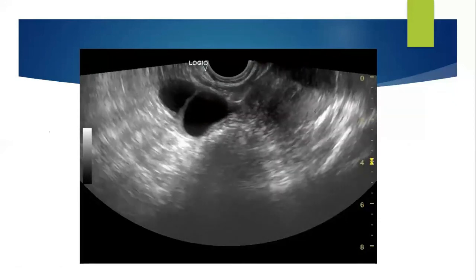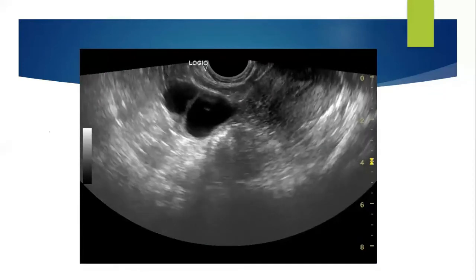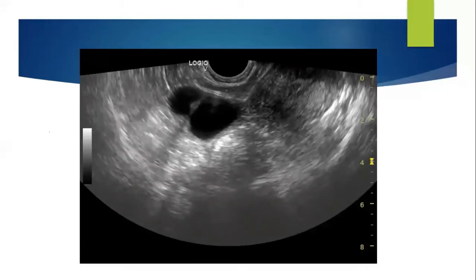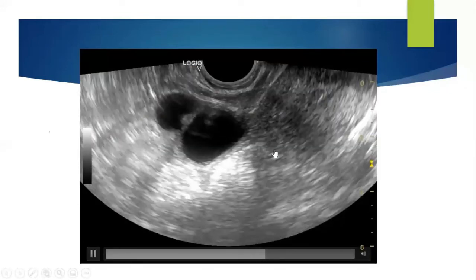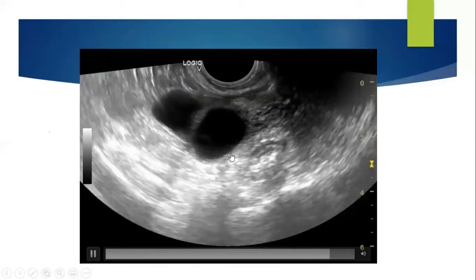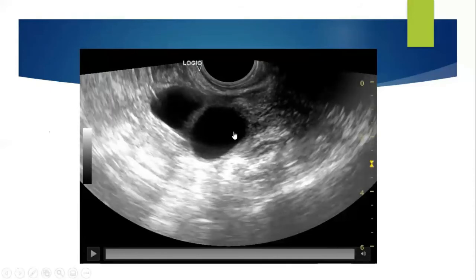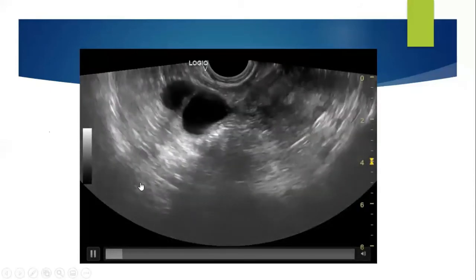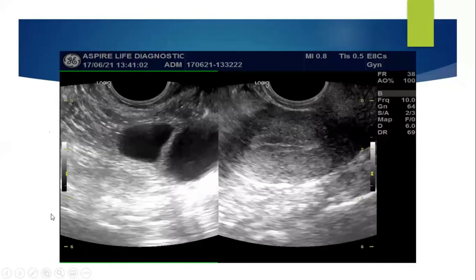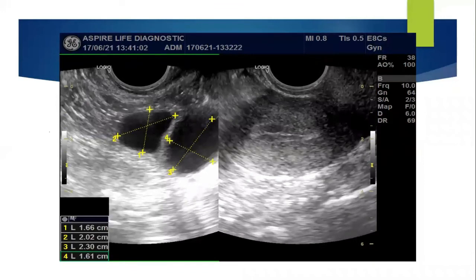Now, see this picture. Can you all identify an ovary with 2 big follicles seen in the right adnexa? Okay. If I'm telling you this is a TVS scan, and I'm now using Zoom to identify where the uterus is, because I was trying to look for the right ovary. So this is how 2 large follicles on day 12 and 13 will look, like a dominant follicle. Then you can take the measurement and also look into the endometrium. As I told you, you will see a triple line endometrium whenever you see a dominant follicle. So these two also should match, in case somebody is doing a lot of infertility practice.